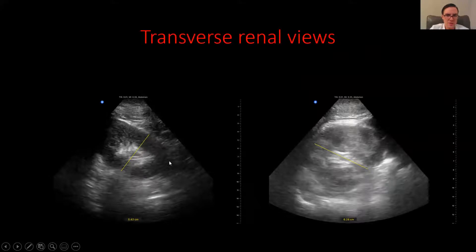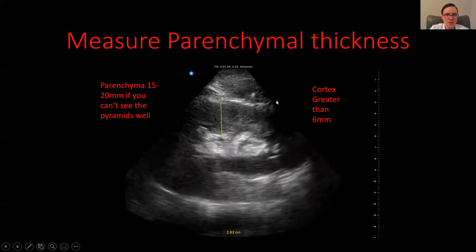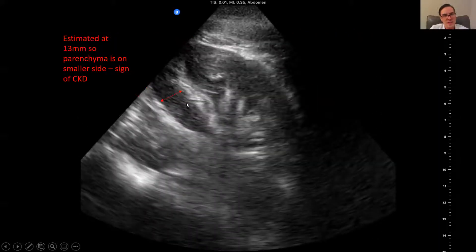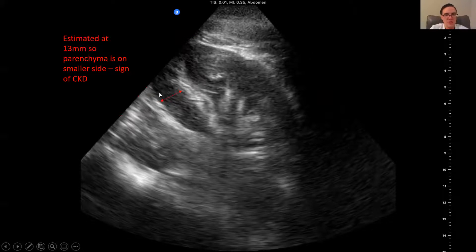Here are some transverse renal views — these are horizontal cuts across the kidney, measuring about five centimeters and about six centimeters, so a little bit large but nothing too concerning. You also want to measure the parenchymal thickness within the internal structure of the kidney. In this example, it's a fairly large parenchyma at about 28 millimeters, well over the threshold where we start to be concerned about chronic kidney disease. By contrast, here's an example of a much more atrophic parenchyma at about 13 millimeters, just under the limit, where we start to be more concerned about chronic kidney disease.